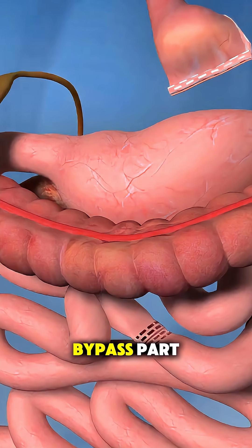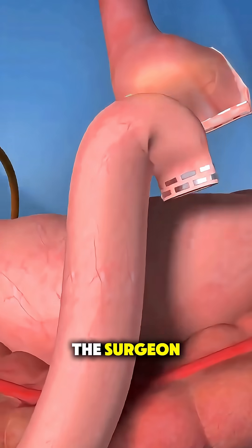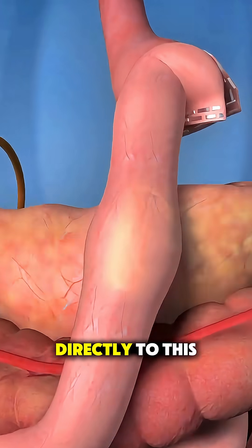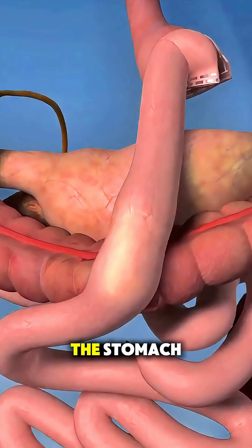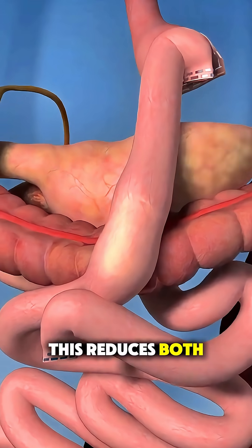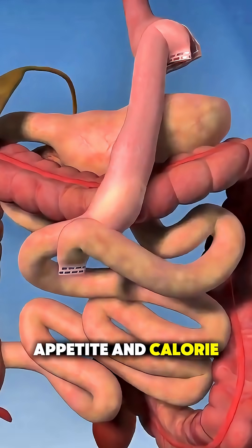Then comes the bypass part. The surgeon carefully brings up a section of the small intestine and connects it directly to this pouch, so food skips the rest of the stomach and part of the small intestine. This reduces both appetite and calorie absorption.